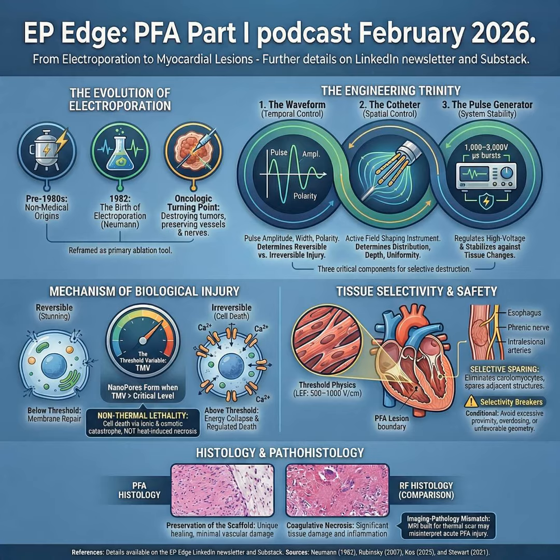Okay, engineering sets the conditions. Now biology decides what the tissue becomes. First, injury mechanisms. The governing variable is transmembrane voltage. The electric field induces a voltage across the membrane based on local field magnitude, cell geometry, and orientation. That's why generator voltage is not dose.